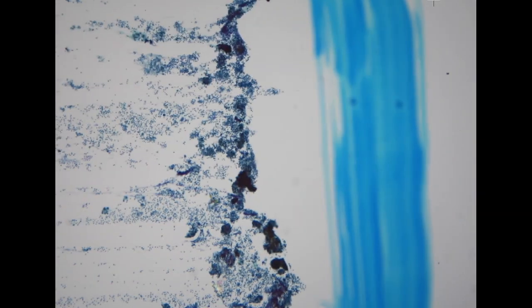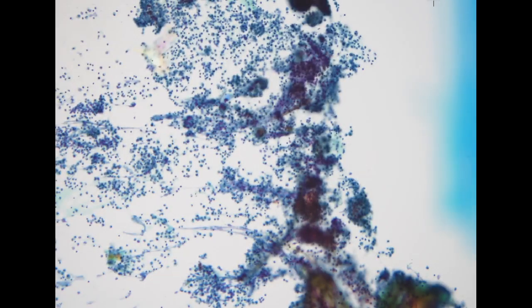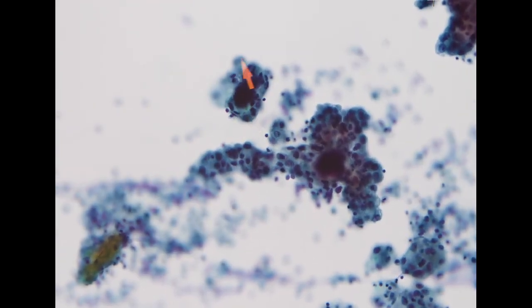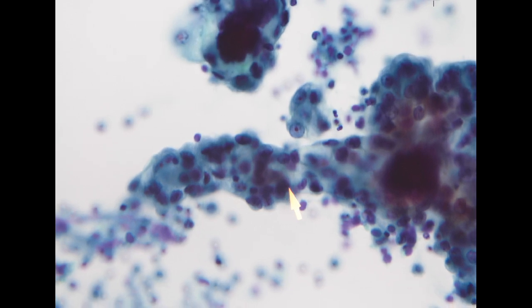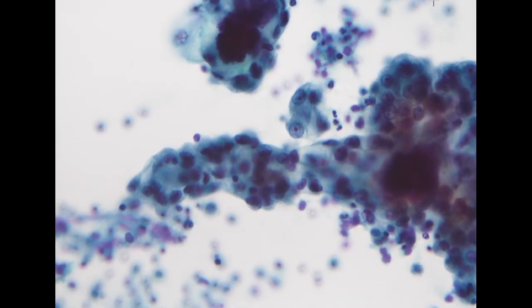The next specimen is from a peritoneal washing. The patient received radical surgery for ovarian cancer. The cancer type is clear cell carcinoma. So here in this washing cytology specimen, we see some core material inside this cluster. It can be a calcified material like a psammoma body, and the cell morphology is high grade with a lot of bubbly cytoplasm, arranged in a glandular pattern.